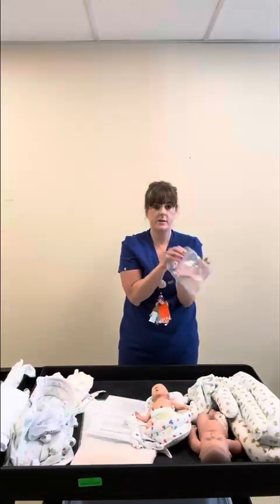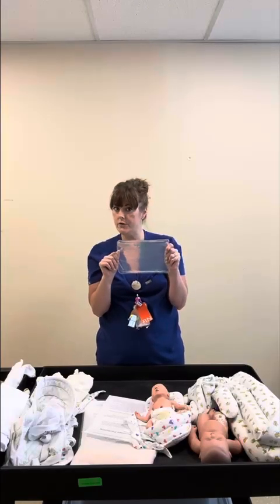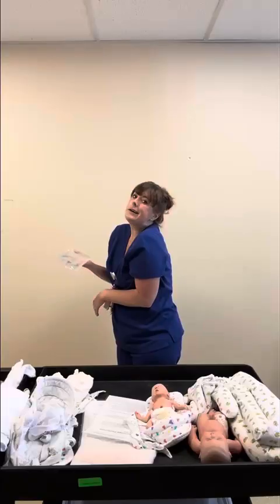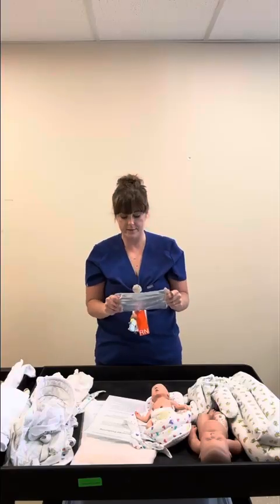Gel pillows. We have a squish on 3. It is very filled, so we are not going to want to use this for our smallest babies. This is only to be used in side-lying position, which I think is new information for a lot of you. It is so that you are not getting that toaster head, townhouse head on the babies as they form their cranial formation. When they're side-lying, the littlest babies kind of crank their heads up, so just try to avoid it. We're looking into smaller gel pillows that are circular, that have less fill for our tiniest babies, so that we can do some pressure relief when they're side-lying.